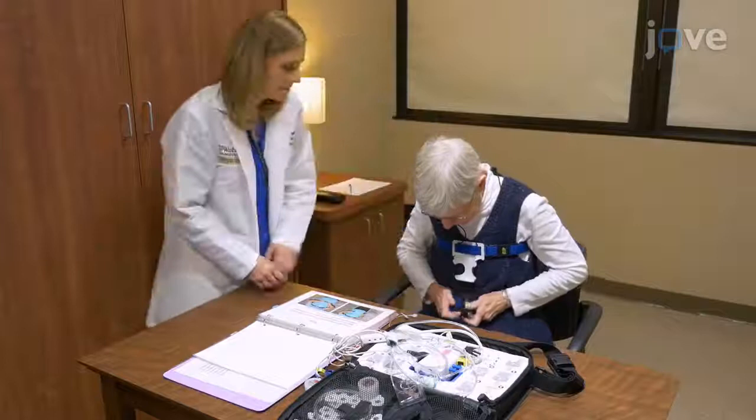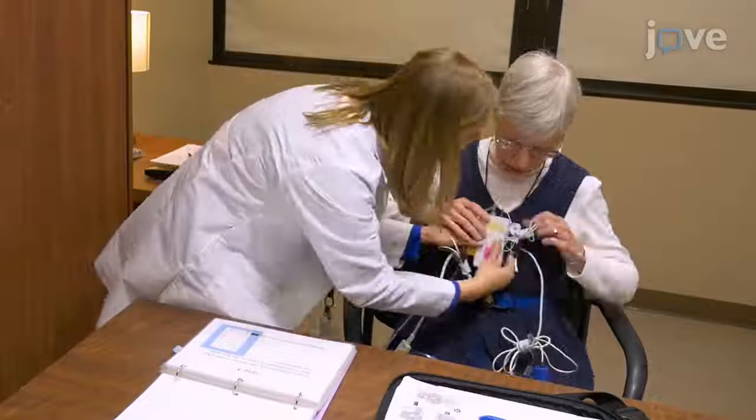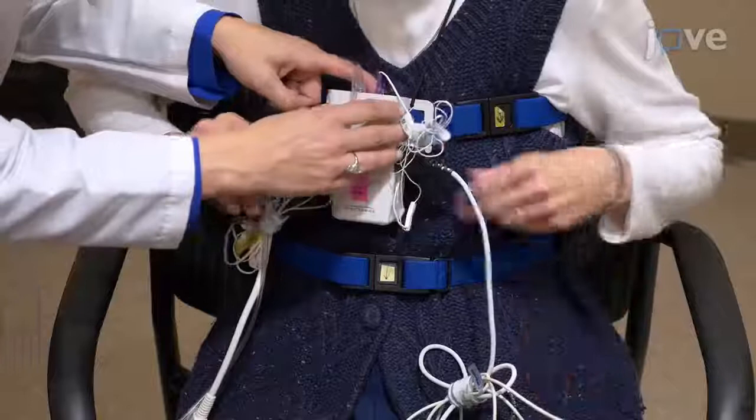Next, snap the white box into the holster on the chest belt and open the device by sliding the button at the top of the device to the right. Plug the chest wires into the port.